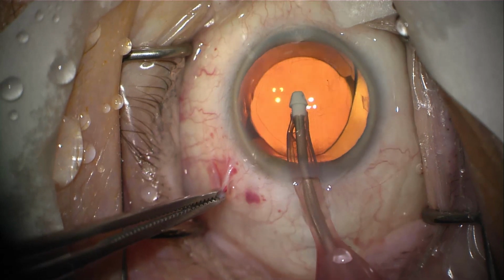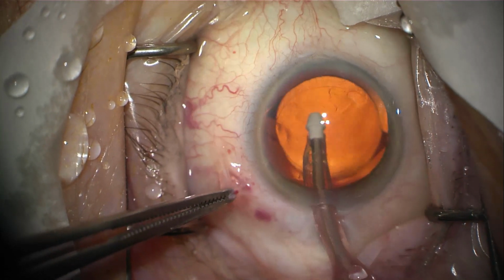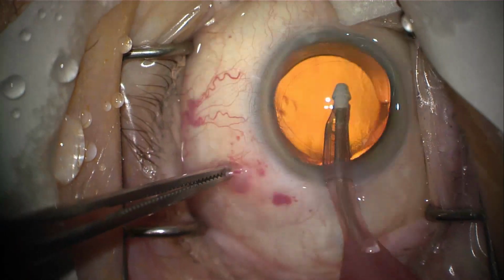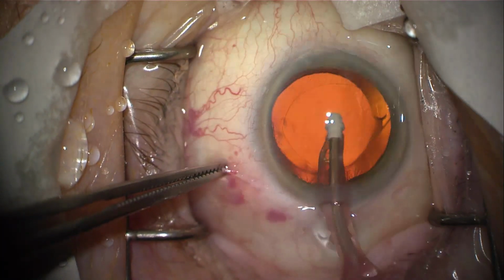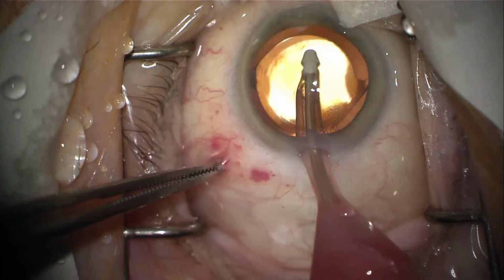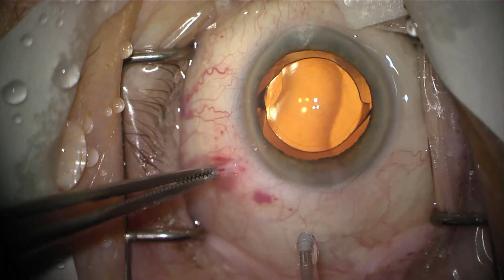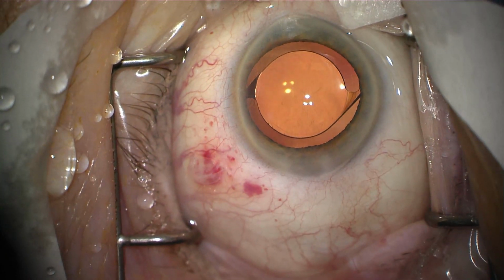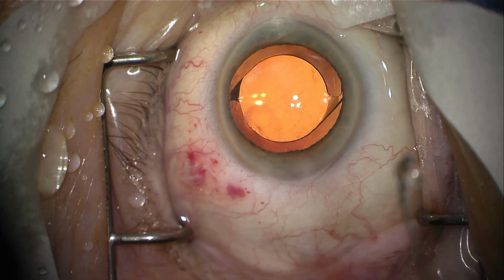of the cataract to remove all of the gel from inside the eye. You can see the lens implant is bumping around and jumping around a little bit because this gel is very thick, and as it comes out of the eye, because I'm suctioning it out, it actually moves the implant. I'm now moving my irrigation aspiration device around to get all the gel out of the eye, because if you leave the gel in the eye, the patient will have very high pressure the next day, which is not a good thing. So we want to remove all the gel.